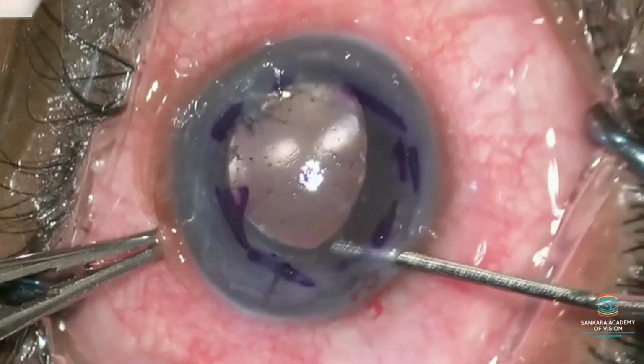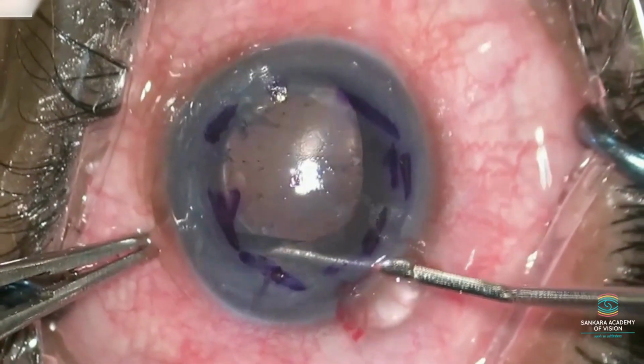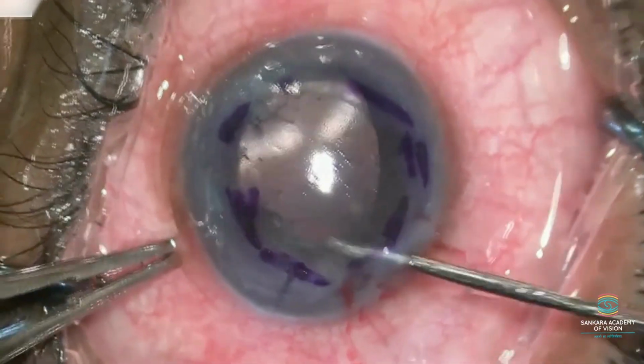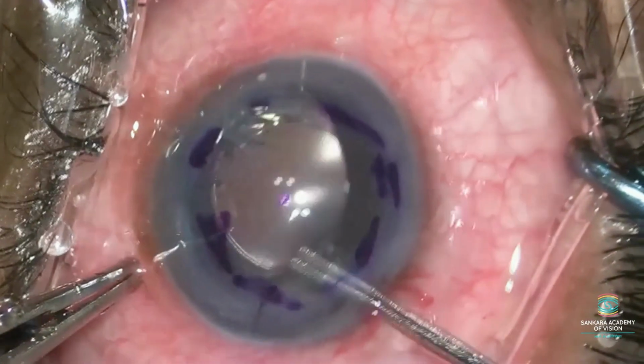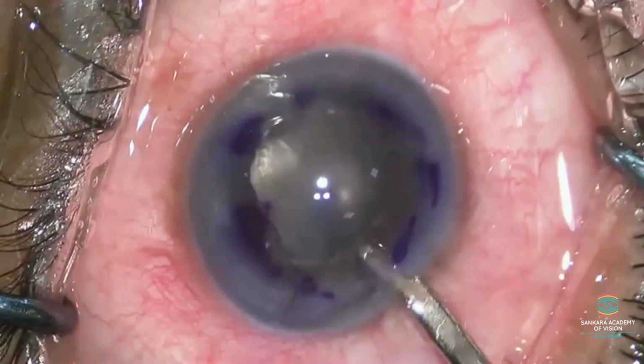Iris repositor is used to break the anterior synechiae. Maneuvering of the instrument to break the synechiae is done in such a way so that there is minimal stretch at the root of the iris, so as to prevent iridodialysis and bleeding from the angles. Visco wash is performed.